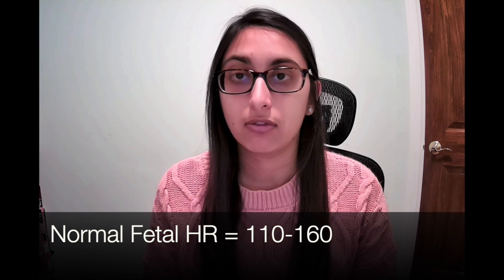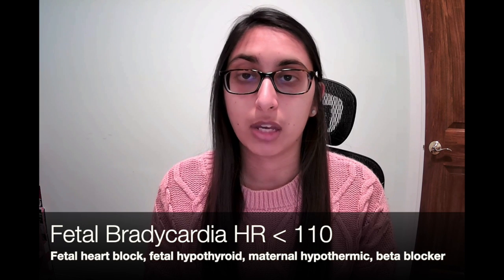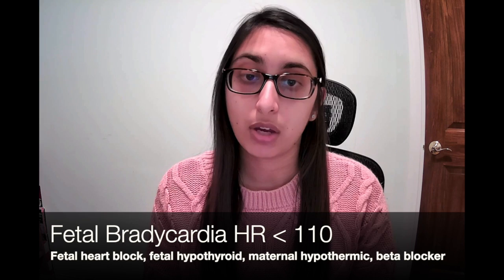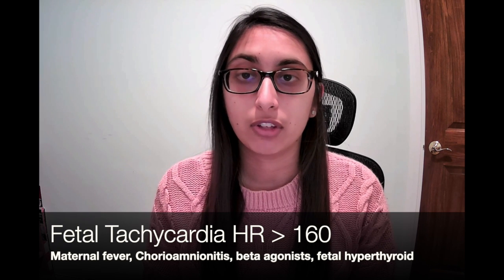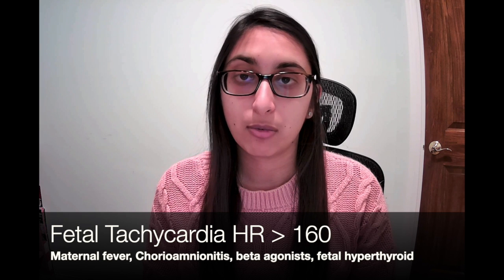Fetal bradycardia is defined as less than 110 beats per minute, and this can occur if the mom is hypothermic, if she's taking beta blockers, if the fetus has hypothyroid, or if the fetus has heart block. Fetal tachycardia is defined by greater than 160 beats per minute, and this can occur if the mom has a fever or if they're taking beta agonists, maybe the fetus has hyperthyroid.